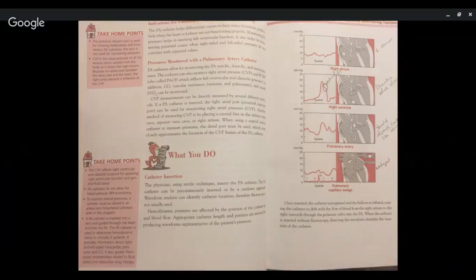The CVP reflects right ventricular end diastolic pressure for assessing right ventricular function and general fluid status. PA catheters do not allow for blood pressure monitoring. To monitor arterial pressures, a catheter must be placed in an artery.